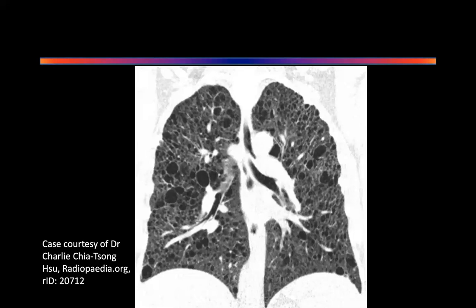Yeah, what do you think it is? Just give me a couple of guesses. I don't mind. You don't have to be right. Sir, there is a honeycomb appearance of the lung. I love the word honeycomb. You're right. Give me a couple of diagnoses on this. It could be a bilateral bronchiectasis of the lung, sir. Bilateral bronchiectasis of the lung.